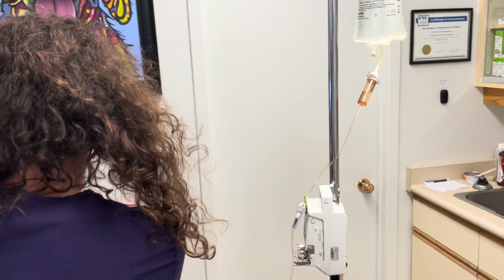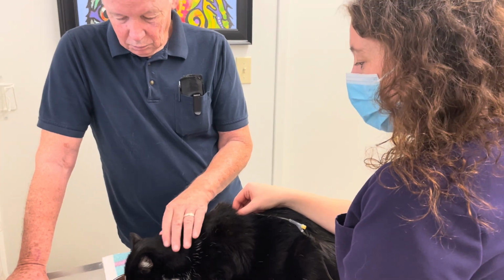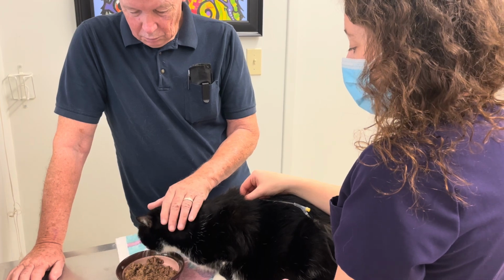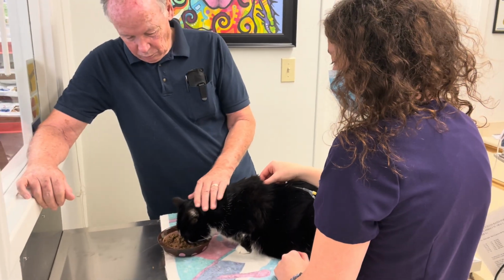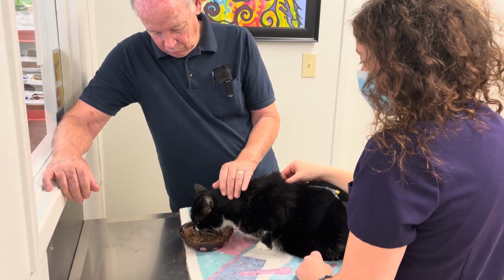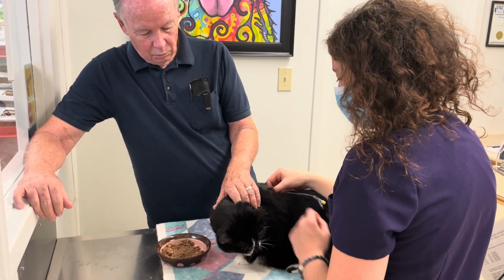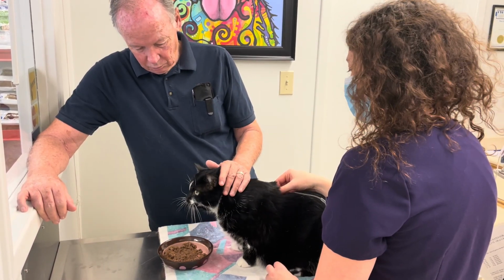Okay, so right now we are going at about 25 drips per 15 seconds. What that's going to translate into is 100 drips per every minute. So if we have 100 drips and it's 10 drips per mil, then that means that we are going to be giving 10 mils per minute. So it's going to take us about 10 minutes to give these fluids to Oreo. Stay pal. Time now is 2:50.